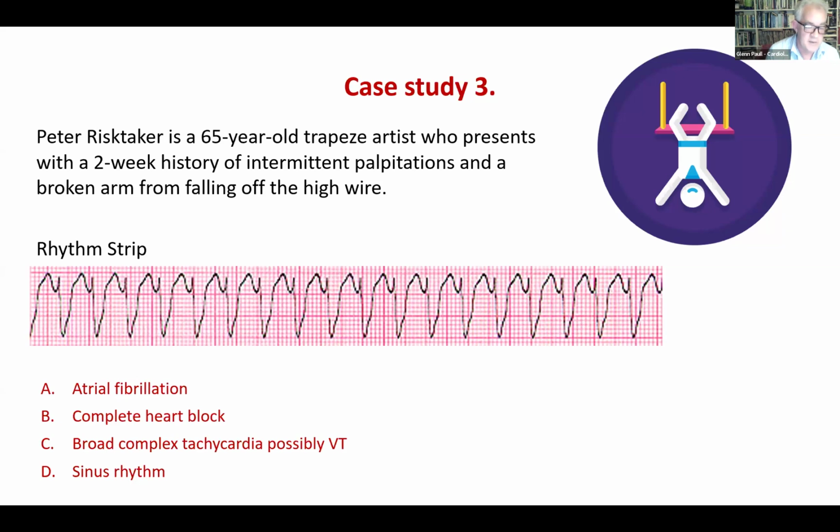But the interpretation would have to be in the context of someone who's 3 months old or 4 months old. And obviously, there are pediatric dots, pediatric electrodes as well, because kids are little, or depends how little they are. But certainly an 11-year-old would be fine. The existing electrodes will be fine on an 11-year-old. But when you're talking about a baby, things get a little bit trickier with how to fit them on the chest. But the anatomical landmarks would stay the same. It's just whether the electrodes are going to fit on the actual physical size of the person.